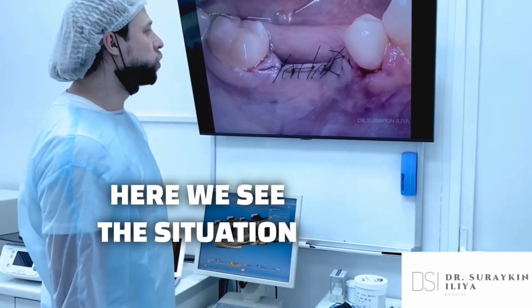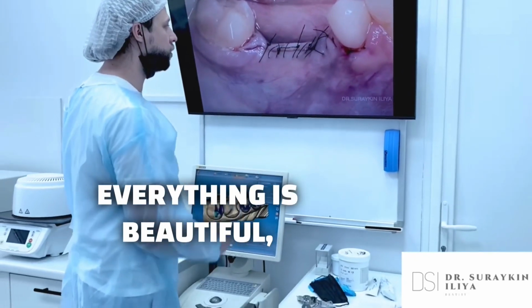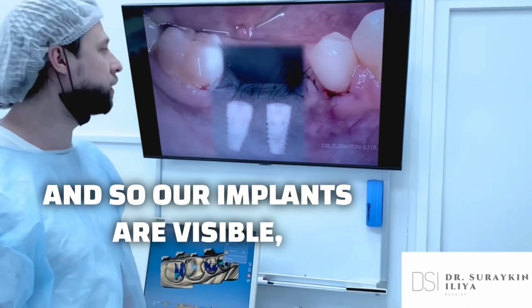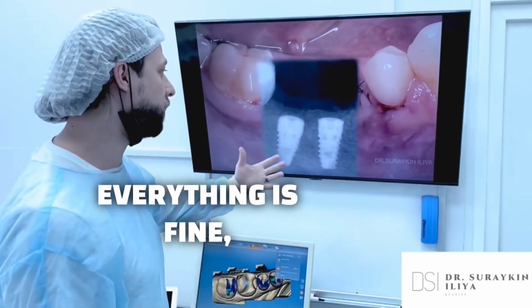Here we see the situation after the implantation. Everything is beautiful, no bleeding. Everything is beautiful, clean, everything is fine. And so our implants are visible, which are located in the thick bone. Here I put a photo with an x-ray image. Everything is fine.